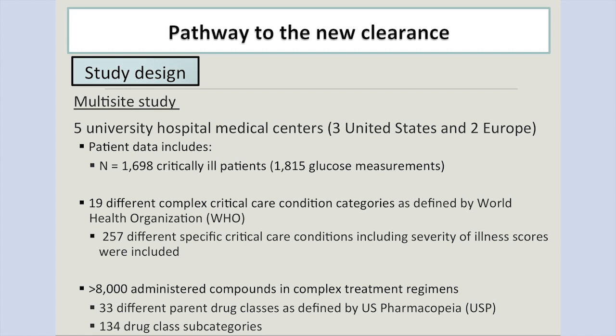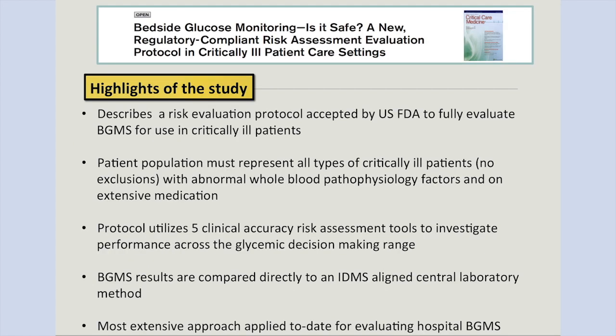So what did we do? What we did was we looked at the typical bias and imprecision. We looked at the correlations that we talked about. We looked at average biases. We calculated sensitivity and specificity values. We did all of that, and like when we all went to school, we're all taught that stuff.